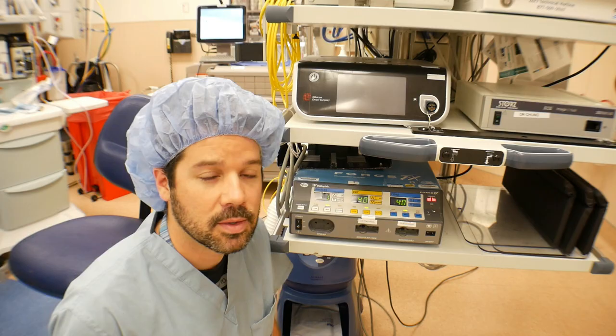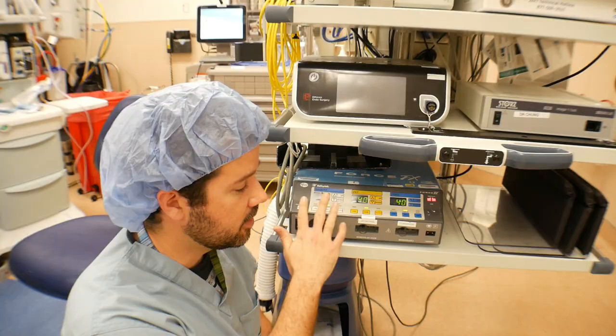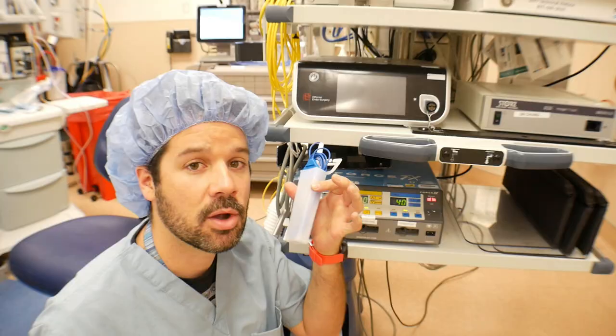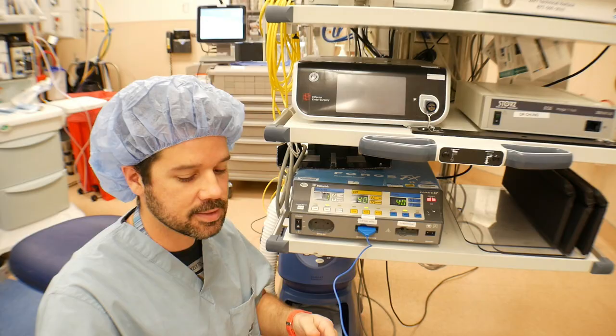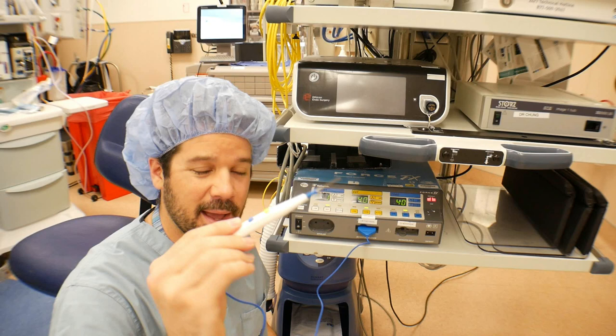So let's break down that ESU circuit. We have our generator — this is on now, and this is our generator. The active electrode, the BOVI that we'll actually be using on the field, is going to be directly plugged in.